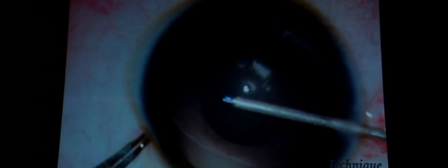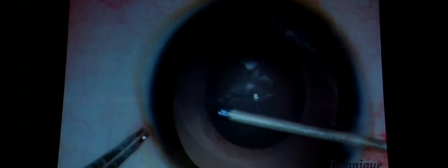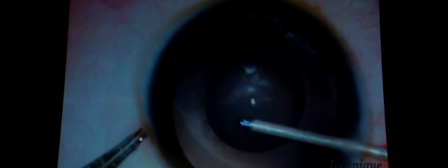With a forceps — whether a micro-forceps or a Utrata through the main wound — the force is centripetal and slightly anterior toward the center of the cornea. Using this kind of force, one is usually able to control the size of the rhexis. Even though pulling centripetally, the rhexis can become fairly large. One must re-grasp multiple times, and because of the high-density viscoelastic, there is very little escape of OVD and the anterior chamber remains stable.